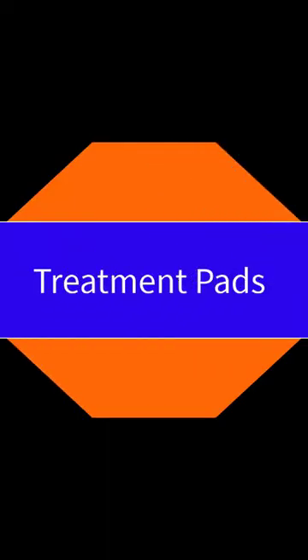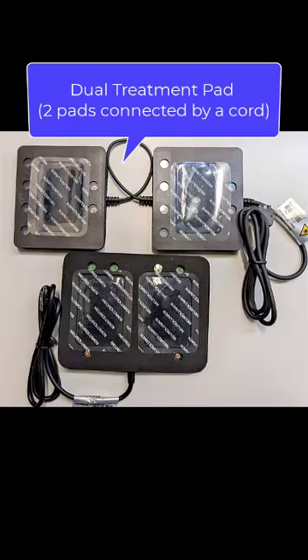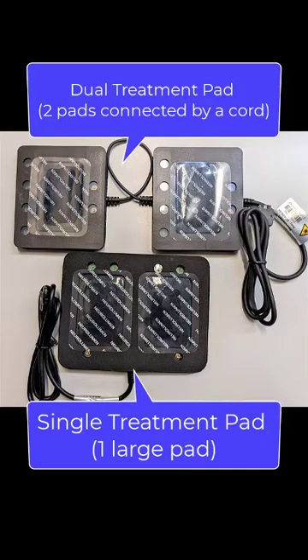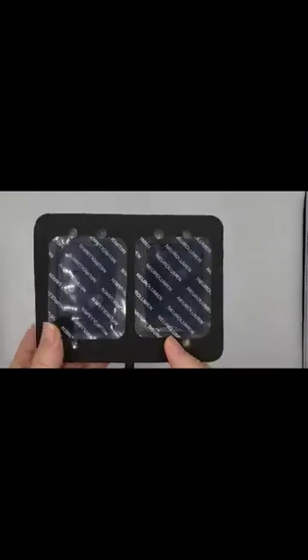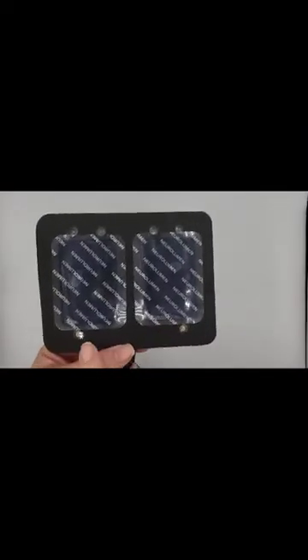Now let's take a look at your treatment pads. We have two types of treatment pads. The dual, which is two pads connected by a cord, and a single, which is a large pad together. The max number of pads that can be used per unit is 4, 2 single and 2 dual treatment pads. If you did not receive all 4 with your order and need assistance on getting additional treatment pads, please give us a call.